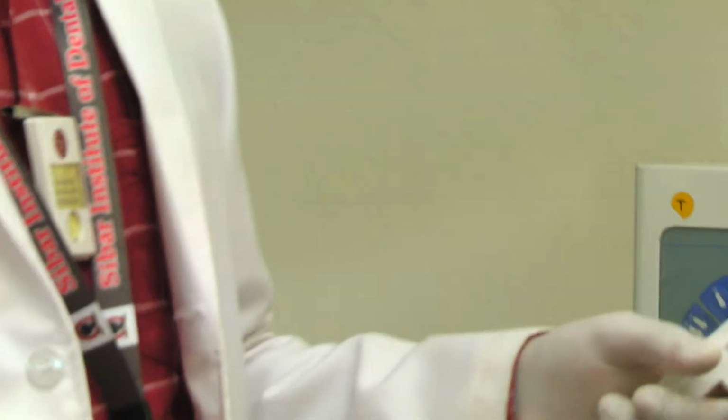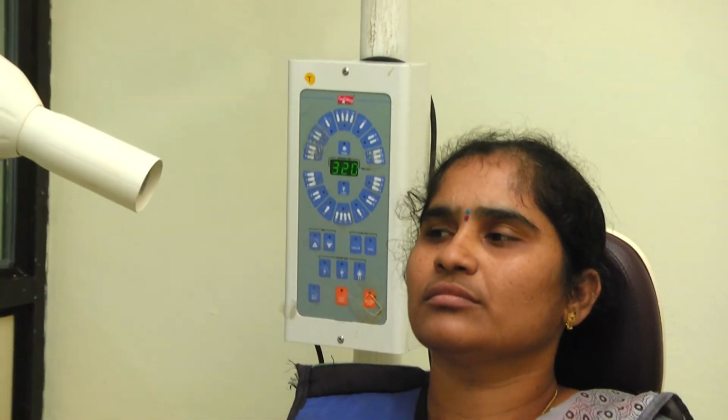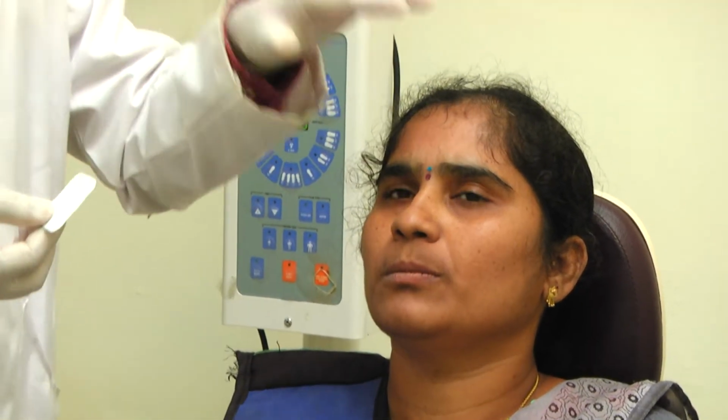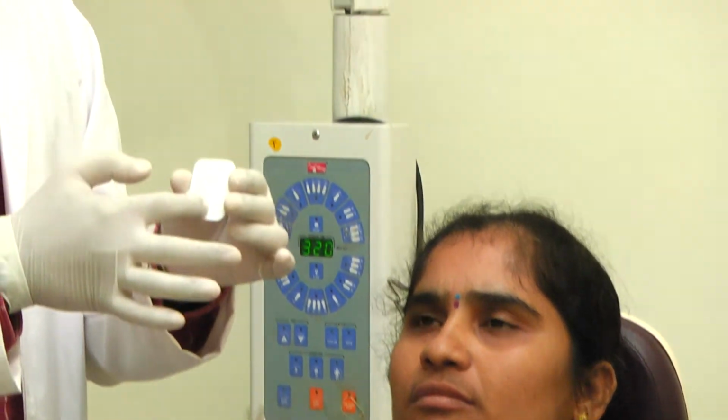And while placing the film in the intraoral cavity, one more fundamental rule is that whenever you are taking an intraoral periapical radiograph, the region of the tooth should be exactly in the center of the film.